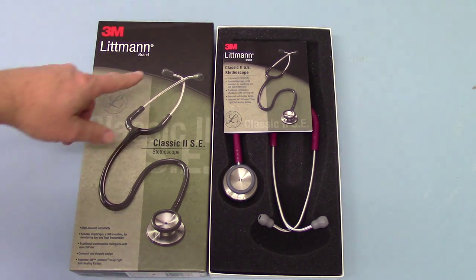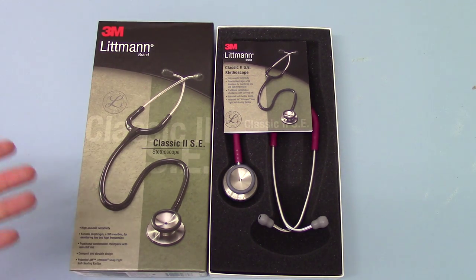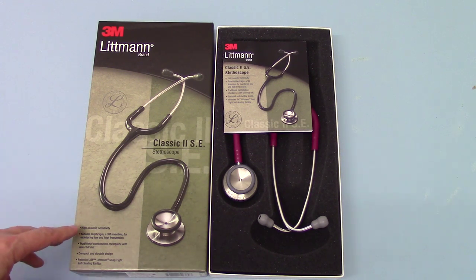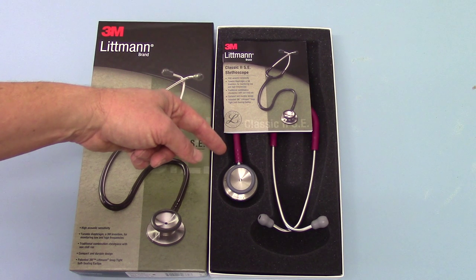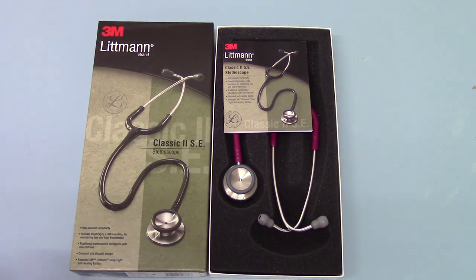This is the box outer showing a graphic of a black tube Classic 2 SE. They claim high acoustic sensitivity with a tunable diaphragm, which is a 3M invention for monitoring low and high frequency cardiac and respiratory sounds. It's a traditional combination chest piece with both a bell and a diaphragm set up with anti-chill rings.